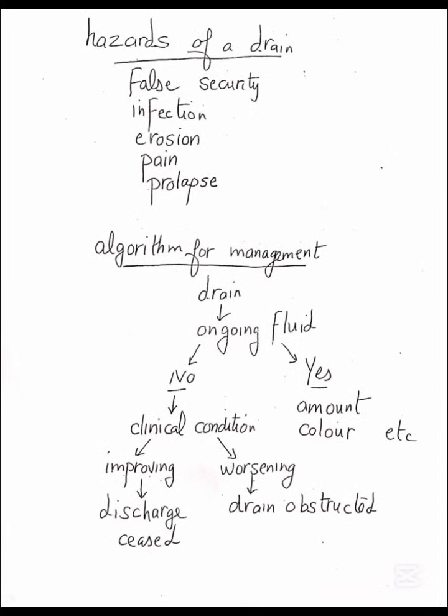We move on to step 3. We determine the trajectory. Based on these parameters, decide whether the patient is improving or worsening. If improving, continue monitoring the drain. If output declines steadily and the patient remains stable, plan for eventual drain removal or discharge. If worsening, we take action.